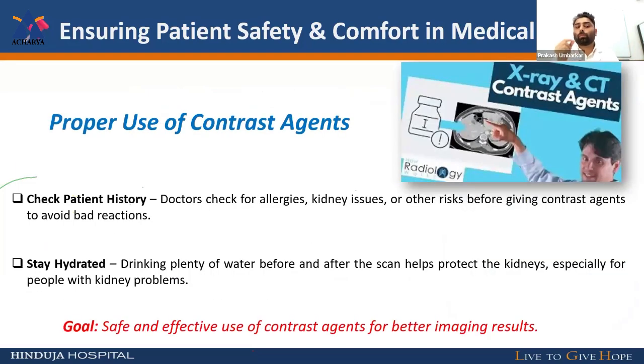Again, third important point, the proper use of the contrast agent. Why is it important? While preparation, that is one step. While loading, that is one step. And while pushing contrast, that is also important. If you look at the two syringes, one is normal saline and one is a contrast agent. Small bubbles, if you don't check and you push them into the patient's body, what happens? What is the complication? That is dangerous for the patient's life also.